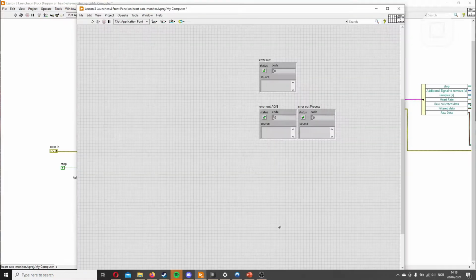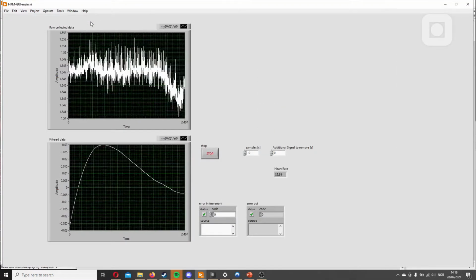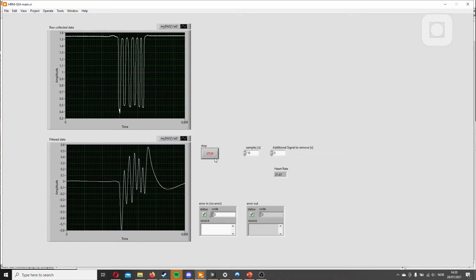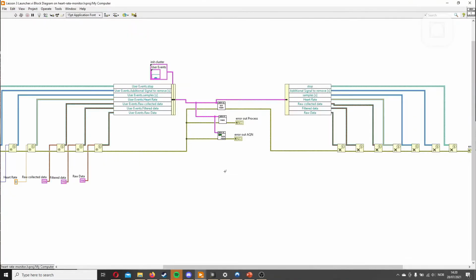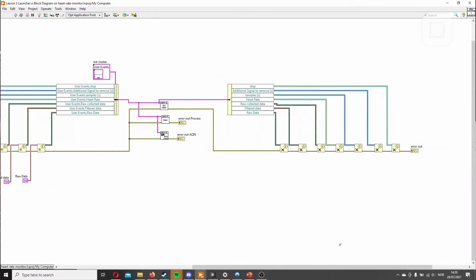And now it should do the exact same thing as it always has, with the only difference being that we should have a pop-up of the GUI. And here it goes. And we tap it, it works just like last time. That's it for this lesson. In the next lesson, we will clean the whole project up and also put the init and the close in its own VI, compartmentalizing the project even more.